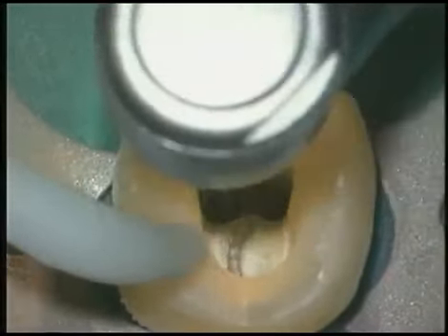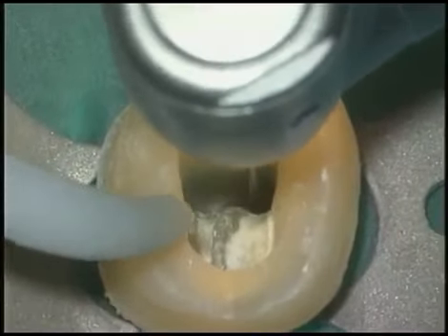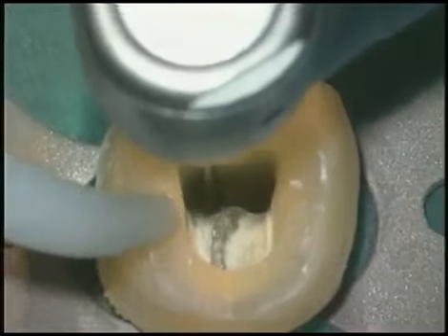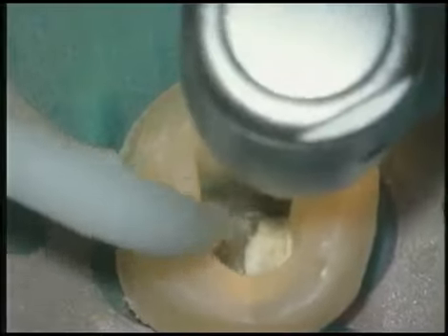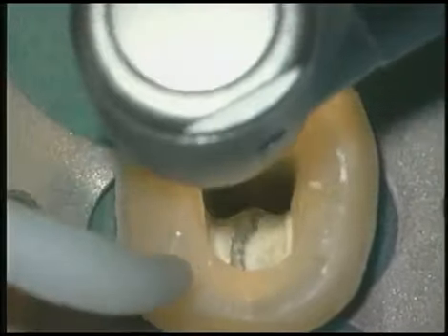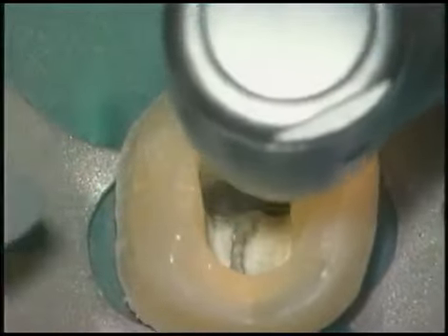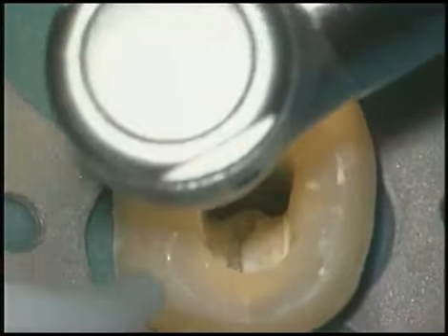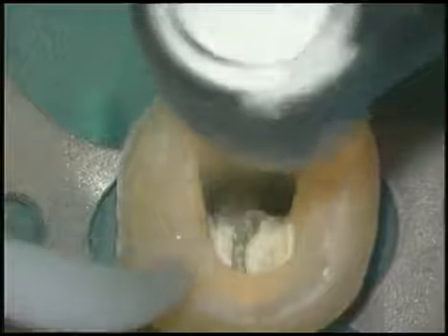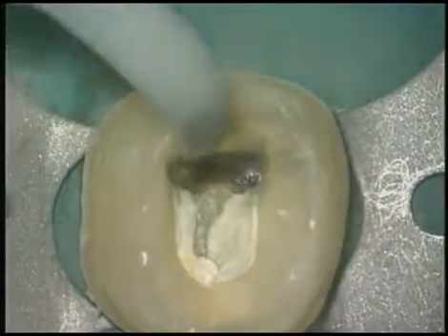It would be analogous to writing with a pencil without breaking the lead. Slowly and progressively, crown down, and we're going to need to crown down until we can visualize the top of the broken instrument. Ultrasonics can really only work in the straightaway portions of the canal. Ultrasonics will not be able to pass lateral to the instrument and around the curve. So if we can expose just perhaps 1 or 2 cutting flutes of the coronalmost aspect of the broken file, we're going to be in good shape.